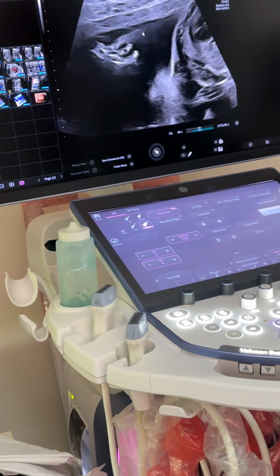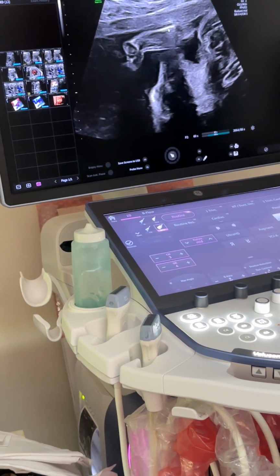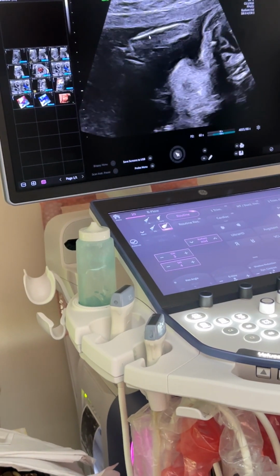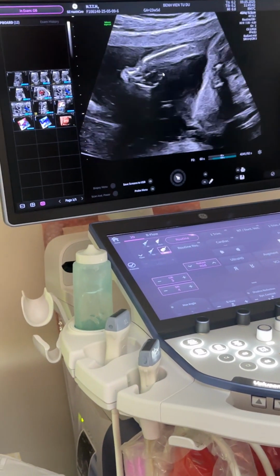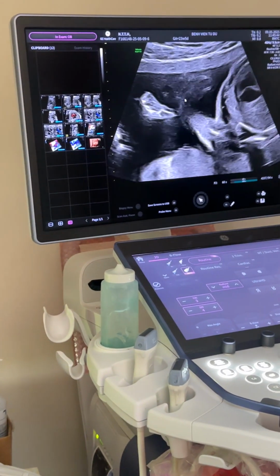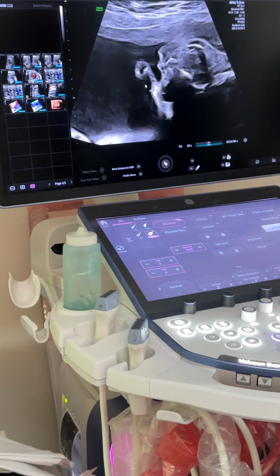and then the arm bone, which I can only see one. I think that looks like an ulna. The shape of it is slightly more curved, like an ulna, and I think the radius is missing. So that's that hand, and then you come down.